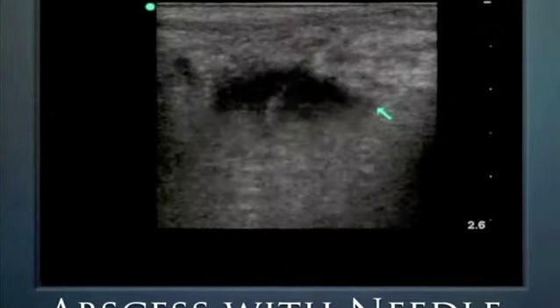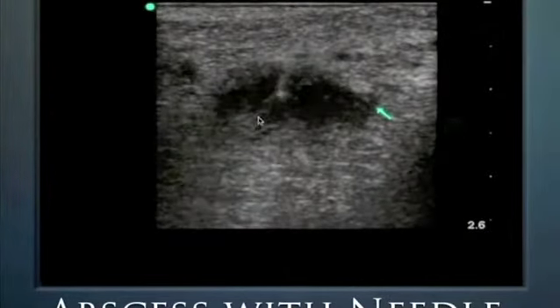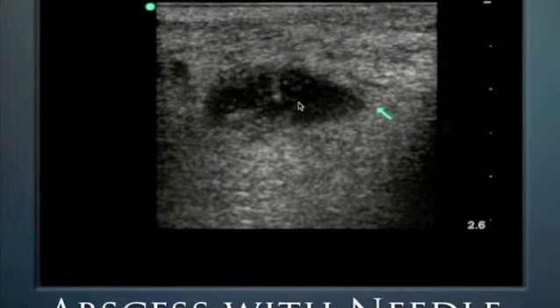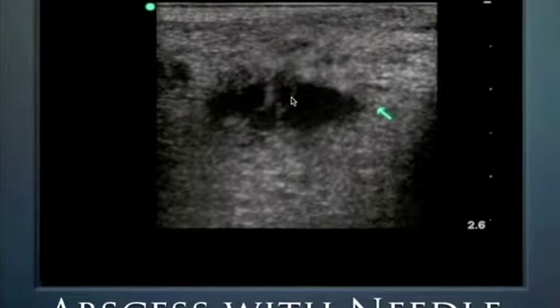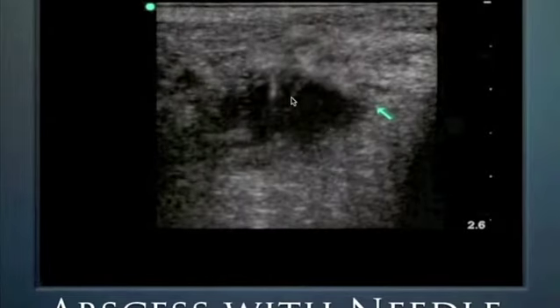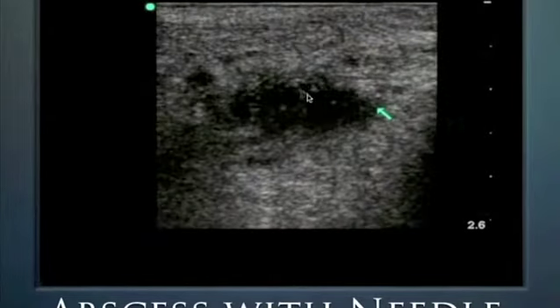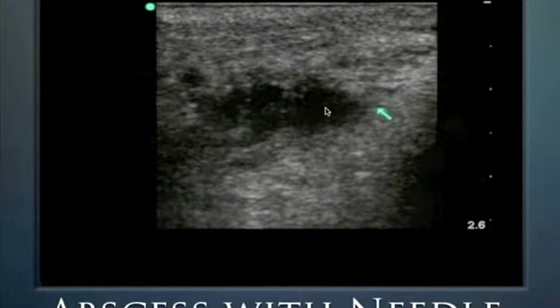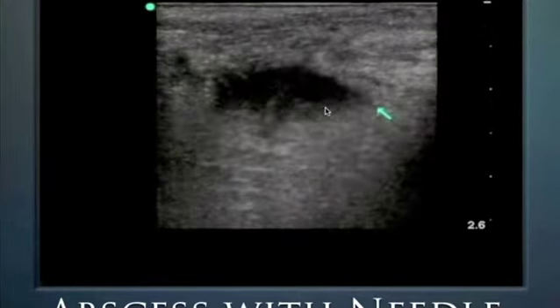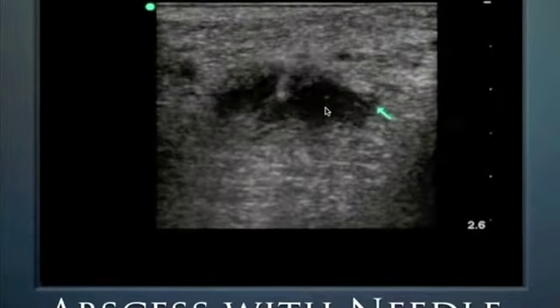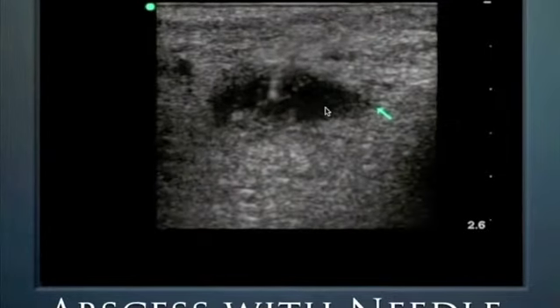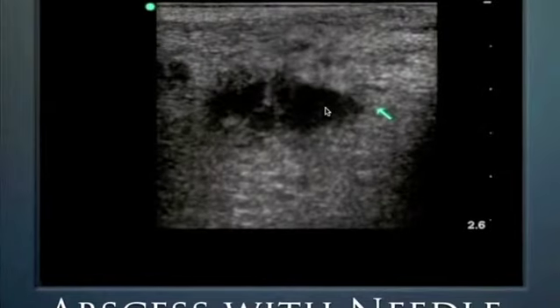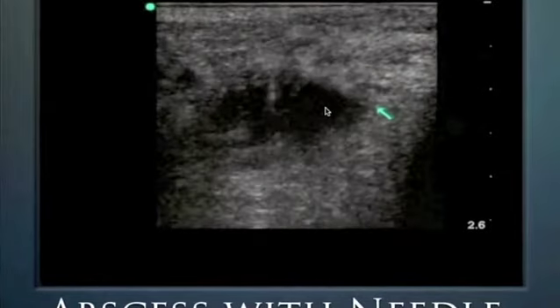Here's an example of guiding a needle down to an abscess to confirm that pus is actually coming out — and to verify it's not a seroma or another fluid collection. In some centers, abscesses are treated by needle aspiration rather than open drainage. If they're small enough, that's exactly what's happening here: ultrasound-guided needle abscess drainage.